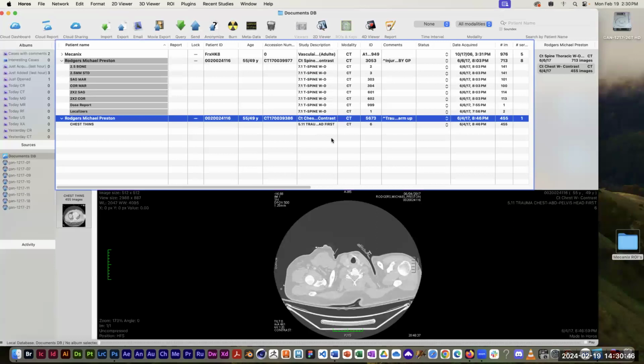All right, so I don't know what the chances are that you'll ever remember that. I don't know how likely it is that you're going to use Horos. You know, it may be 10 years before you ever come across a data set that doesn't have the slice interval in it. But maybe, just maybe, if you ever run into this, some little spark in the back of your brain saying, wait a minute, I remember Jim said something about things coming in upside down and flipped mirror image.